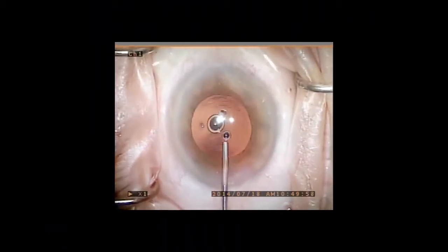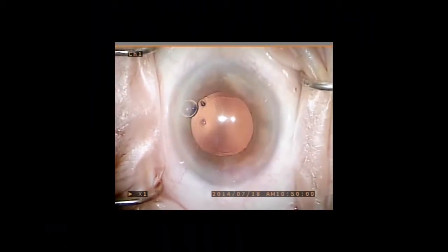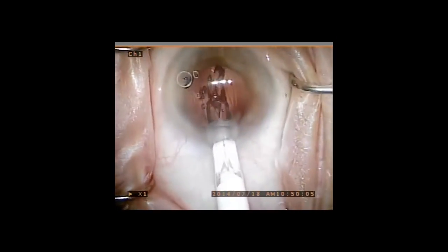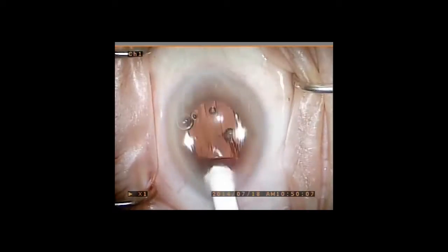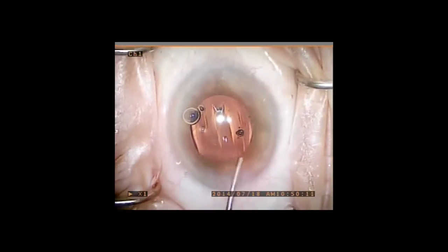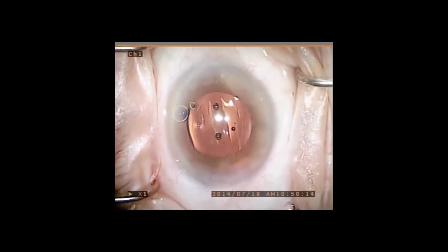In this next case, a LensTech HD monofocal lens is placed into the capsular bag. Only a small amount of viscoelastic is placed in the bag in order to avoid overexpanding it. Then the ciliary sulcus is expanded with viscoelastic until the anterior capsular edge is visible.